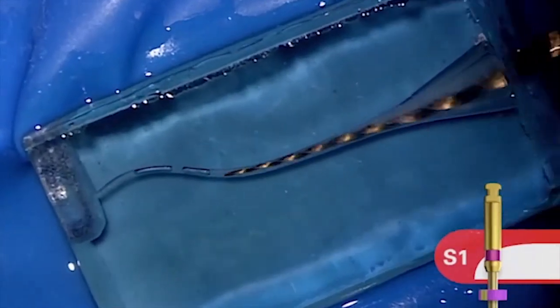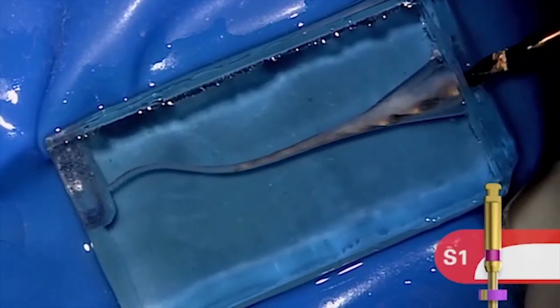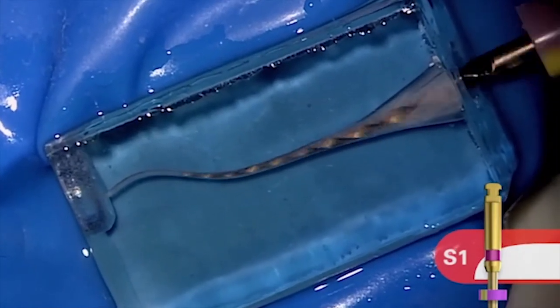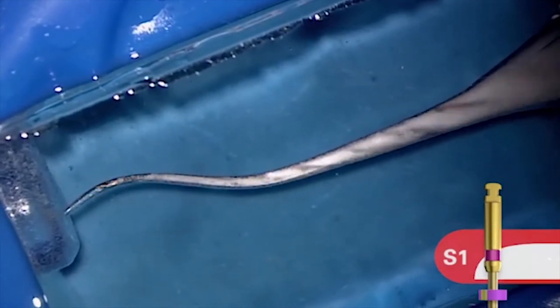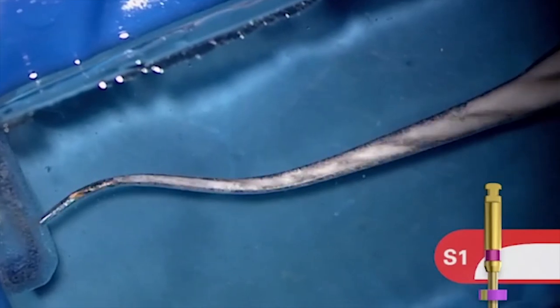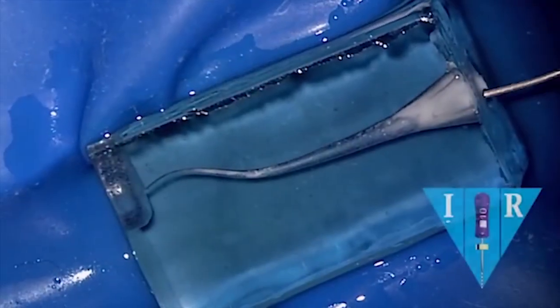Here comes S1. You don't have to know much about its geometries — it's purple. We know around the world the ISO color sequence to follow is purple, white, yellow, red, and so on. Notice I'm brushing. This canal is being pre-enlarged dominantly in its coronal one-third. Notice where the file is loading up — the tip of S1 is just following the glide path that was created by the 10 and the ProGlider. Once we've achieved length, we can remove the file and irrigate.